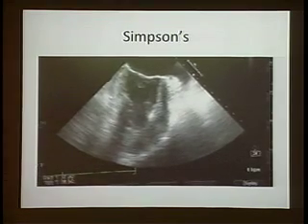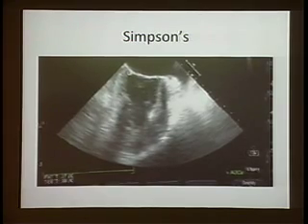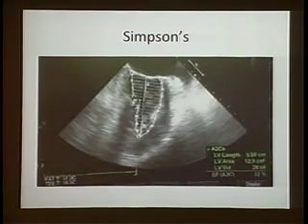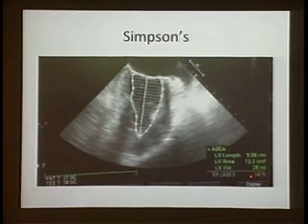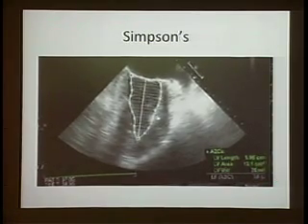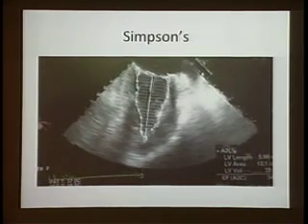Then you move it now into your systolic frame and do the same thing. You put it on the hinges, you drag your cursor to the apex, and look at what you're getting here. The EF is being generated in front of your eyes as we speak. And this takes 20 seconds. Okay? This is how it's done.